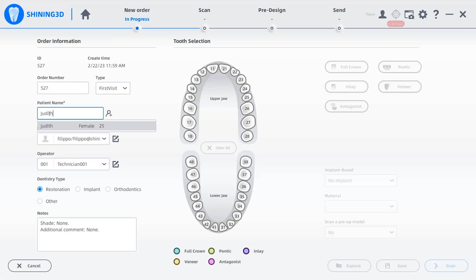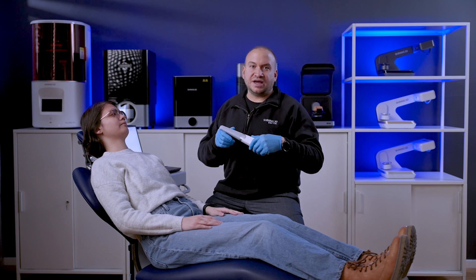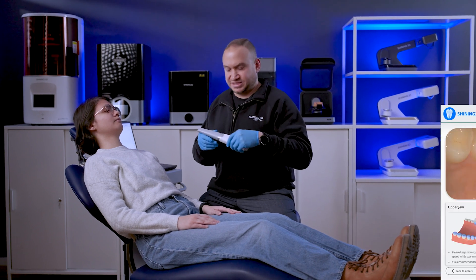Let's start by defining a simple ortho case to proceed with the acquisition phase. Pressing the button on the scanner body, we can start the scan phase. Look how easy and smooth the scan process is.